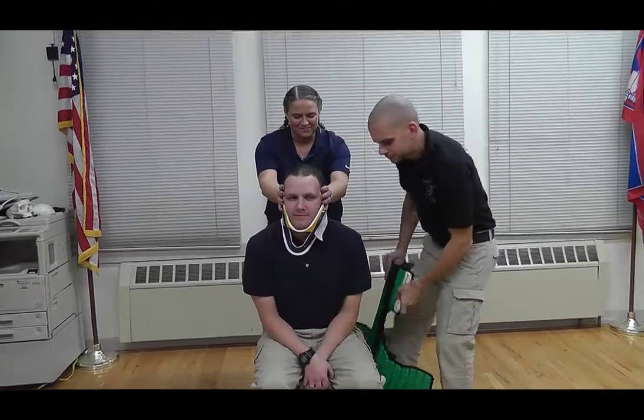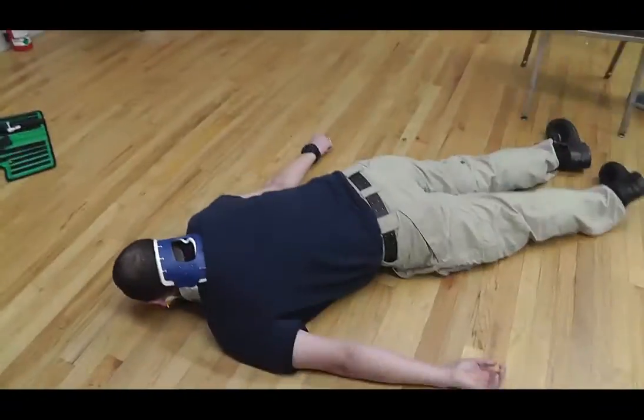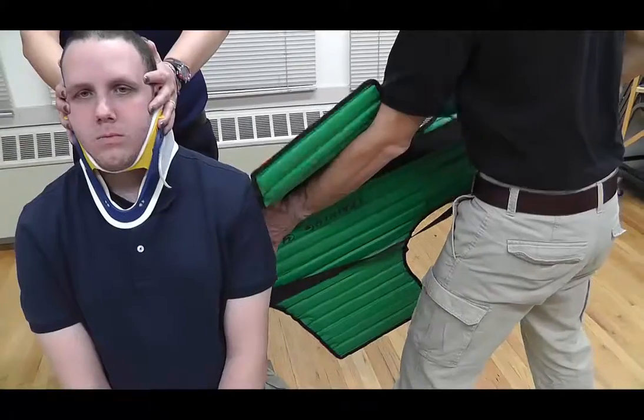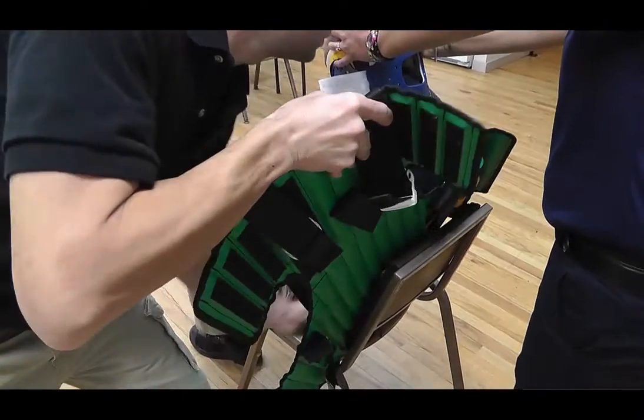We interrupt this regularly scheduled practical skill station for me to blow your mind. How many of you folks still go through the hassle of counting to three and moving the patient back? Did you know that the KED is designed so that it can be placed behind the patient's back without having to move them forward at all? If you place the KED at an angle, it will not get caught on the patient's belt. Then all you have to do is simply adjust it upward and it will be at the perfect placement behind the patient's back. Now we will resume your regularly scheduled practical skill station already in progress.